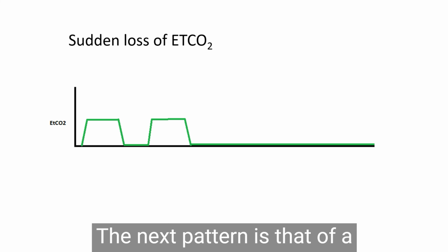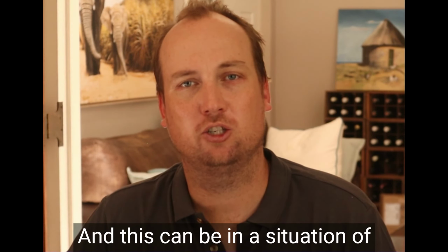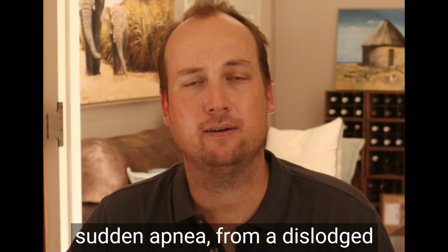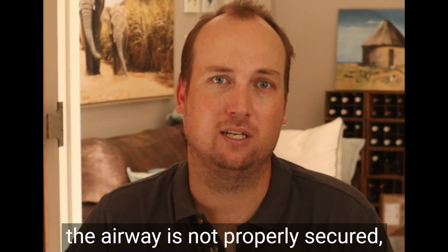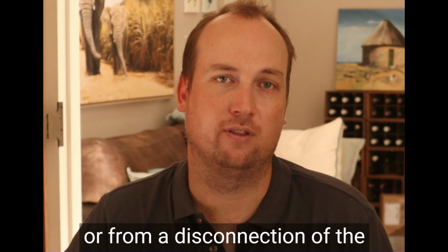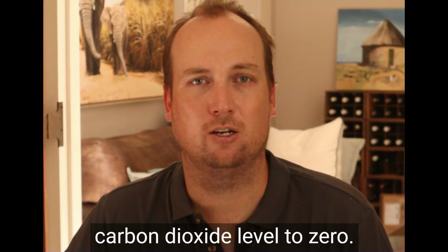The next pattern is that of a sudden large drop in end-tidal carbon dioxide level to 0, and this can be in a situation of cardiac arrest, in a situation of sudden apnea, from a dislodged airway, which can occur anytime if the airway is not properly secured, or from a disconnection of the breathing circuit from the airway. So that is a sudden drop in carbon dioxide level to 0.